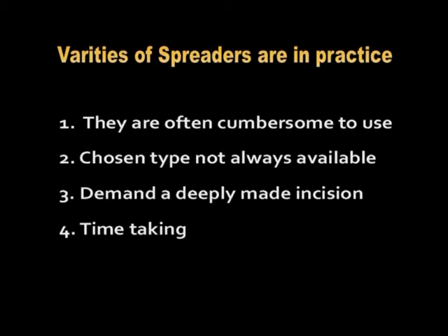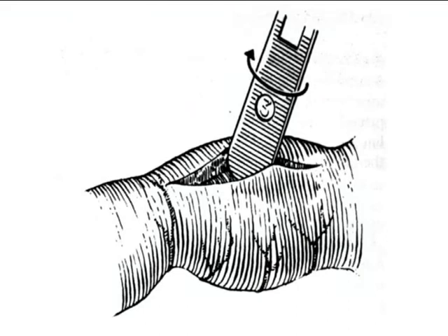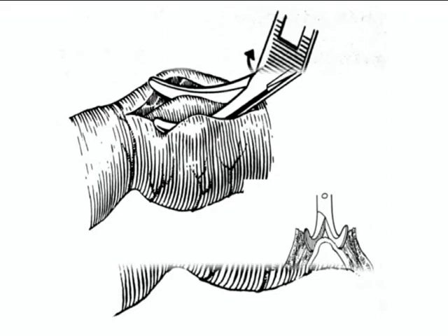Varieties of many other spreaders are described, and surgeons prepare and adopt their own technique. Many of the spreaders are often cumbersome to use and demand a deep incision to accommodate, and the procedure is also time-taking with their use. A twisting movement of the scalpel handle is often used by some surgeons for muscle spreading. Opening the shoulders of a curved hemostatic forceps is the most commonly used practice.